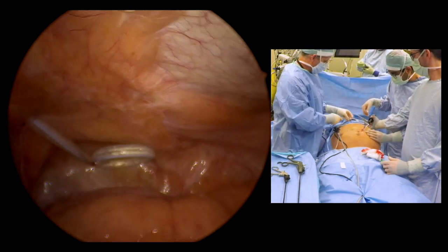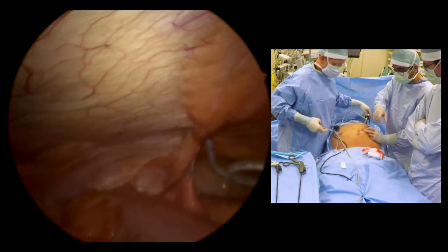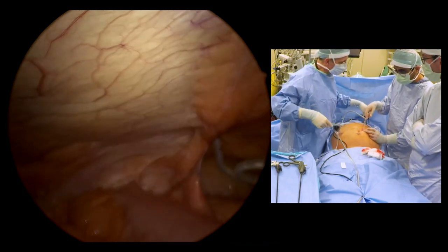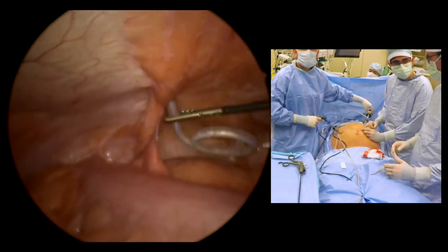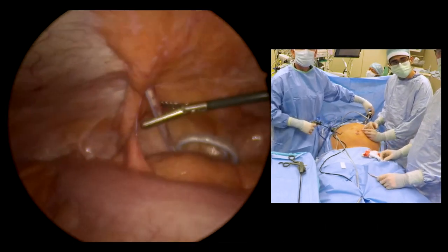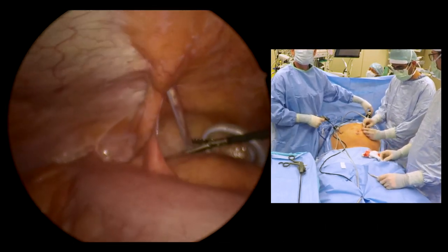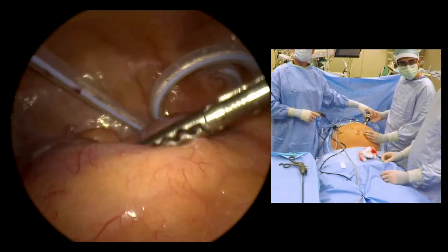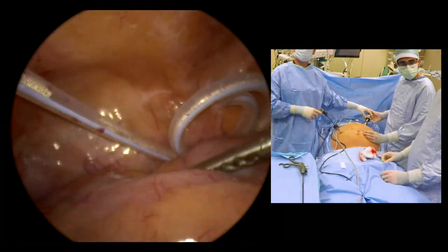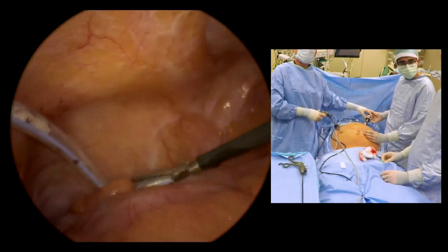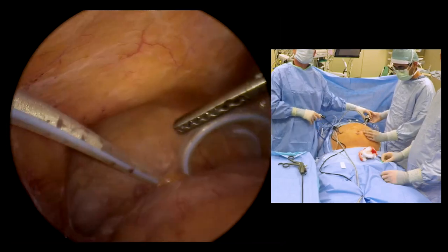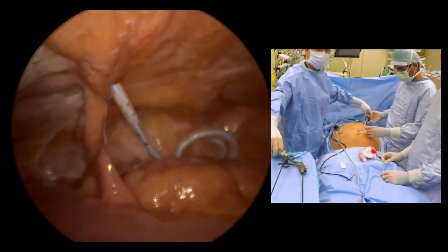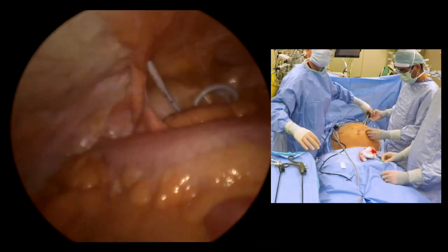The entrance site is then dilated, and with the assistance of a grasper from the right lower quadrant port, we push and pull on the catheter until our deep cuff is situated firmly within the rectus muscle. Next, we confirm placement of our catheter tip within the true pelvis. And the loop guide assembly plastic peel-away sheath is fully removed.